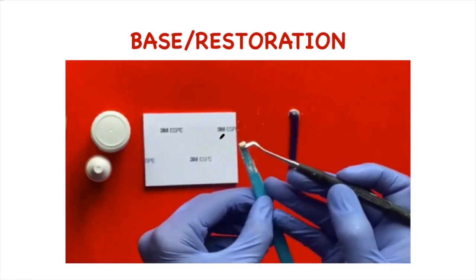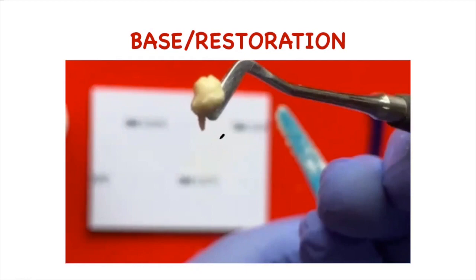You can see that this cement is ready to be used for base or restoration — the consistency is such that we can pick the cement without it sticking to the instrument. Can you see this glossy surface of the mix? This glossy appearance is due to the presence of unreacted polyacrylic acid, which is responsible for adhesion of the glass ionomer cement to the tooth structure. The loss of gloss test shows the end of the working time of cement, which is 60 to 90 seconds for conventional glass ionomer cement.